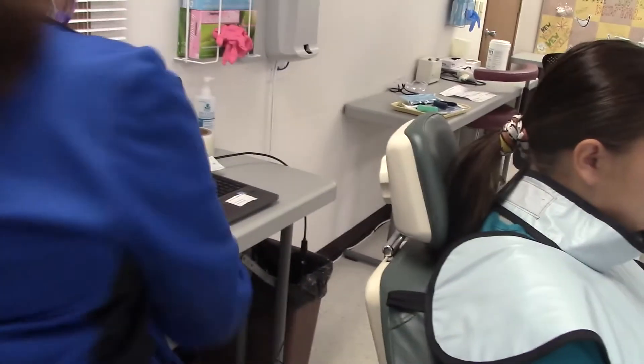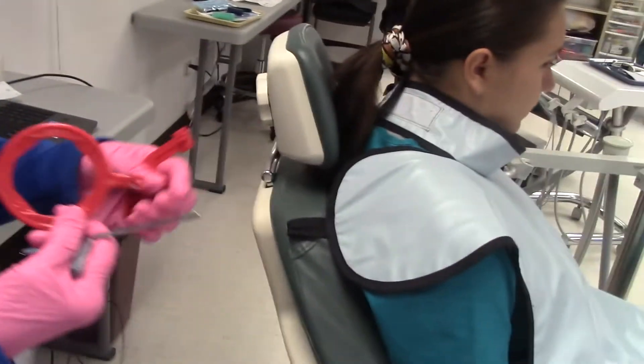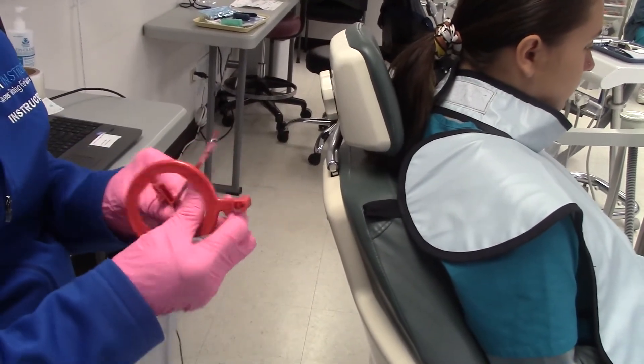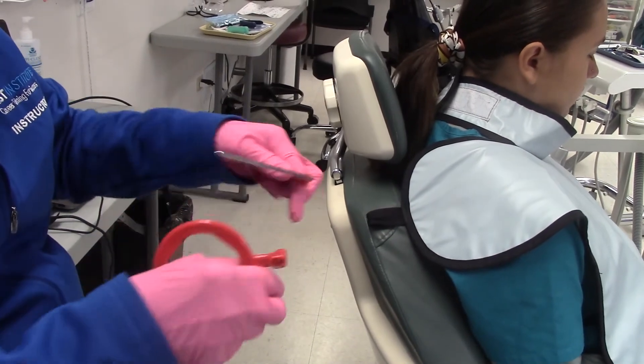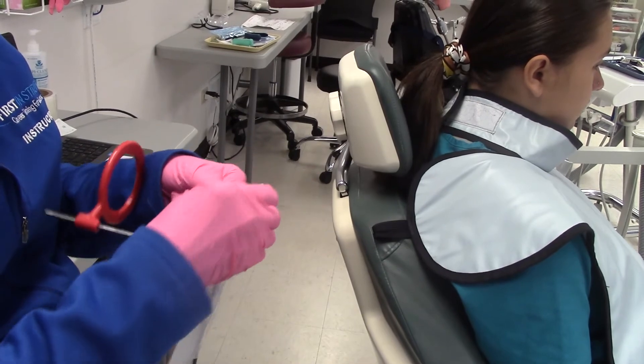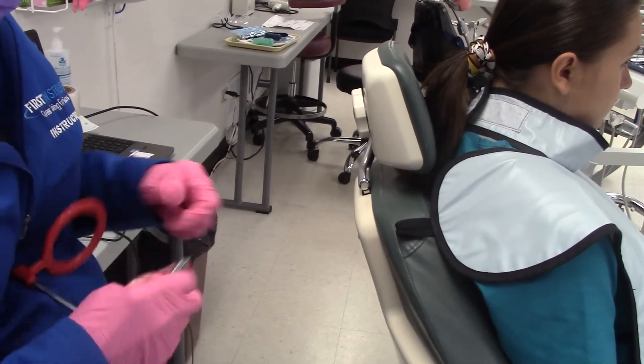The next thing we're going to do is put together our bite-wing holder called an XCP. Our sensor gets attached to the bite-wing holder.